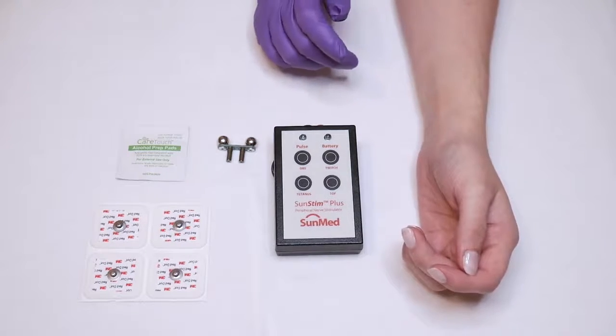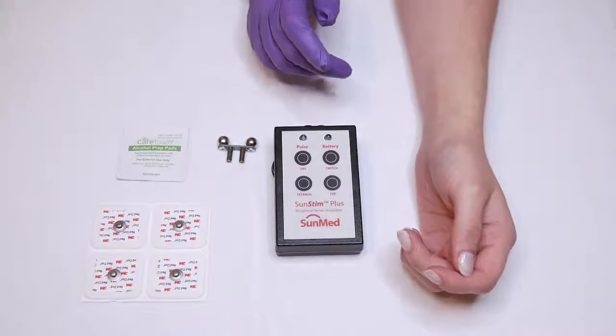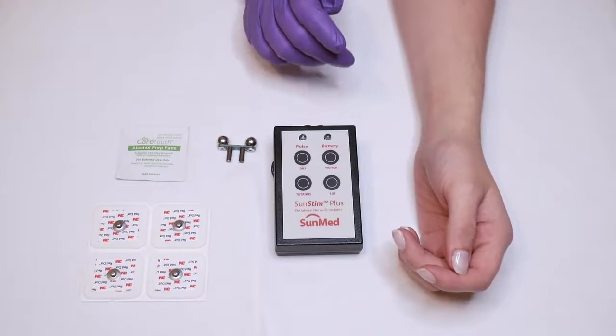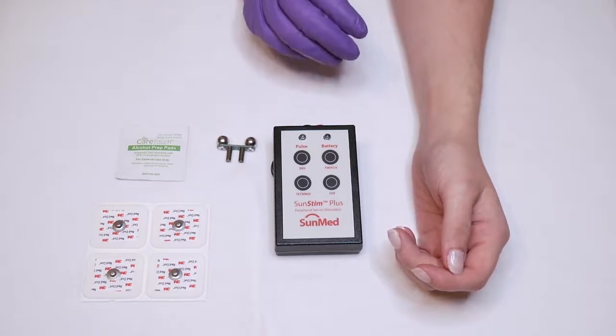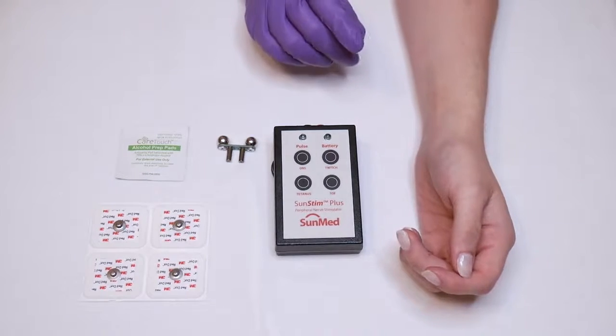You want to make sure that you are not stimulating muscle — in this case, the adductor pollicis. If you are stimulating the muscle, it will contract even during deep sedation, so correct electrode placement is imperative.